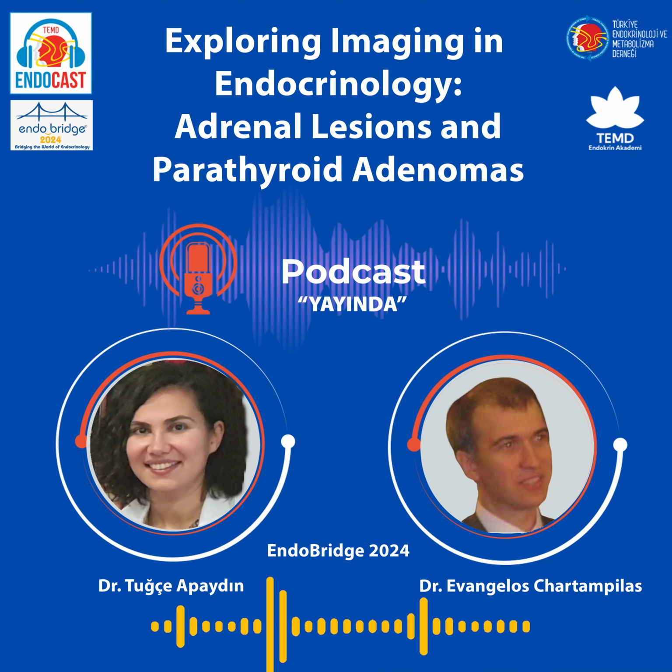If we go for the cross-sectional images, I'm a radiologist, I don't have much experience with nuclear imaging, but from my point of view, you can use a 4D CT or 4D MRI. There are some reports of advantages of 4D MRI due to diffusion imaging or the high T2 signal of the adenoma, but I wouldn't depend on this. If you perform a nice 4D CT, you can diagnose your adenoma with quite some certainty.